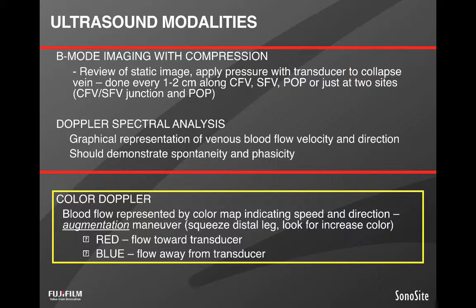You'll see a lot of different terms in explaining how we look for DVT, things like duplex and triplex. Again, I'm not going to necessarily define them, but just keep in mind that although we're advocating compression ultrasound with B mode, or really what we call nowadays 2D imaging, there are other ways to identify abnormalities in flow that is suggestive of thrombus.